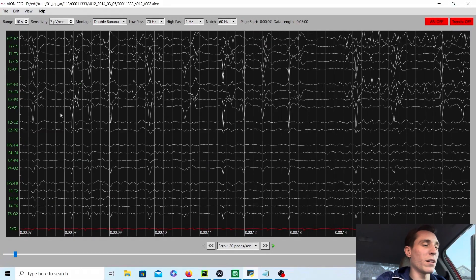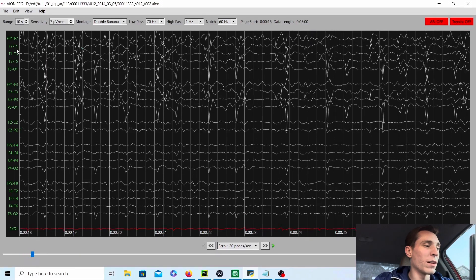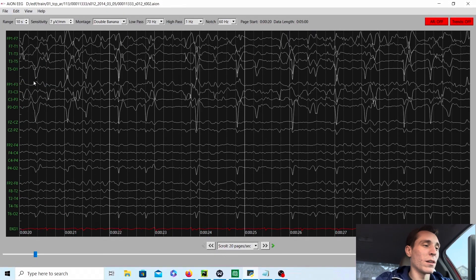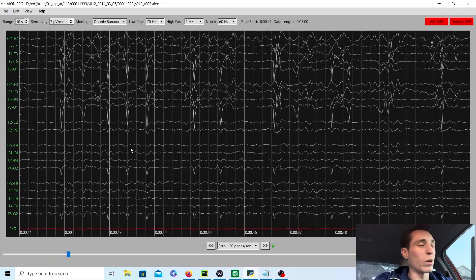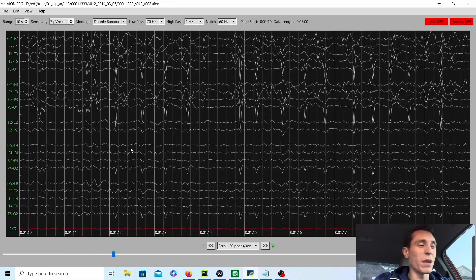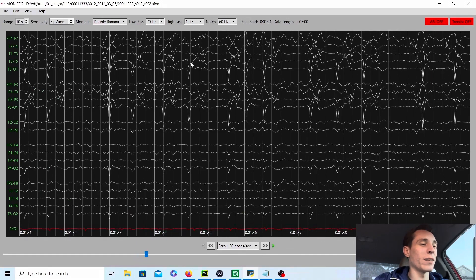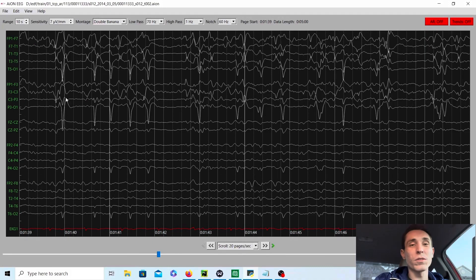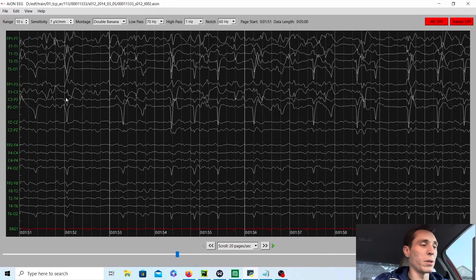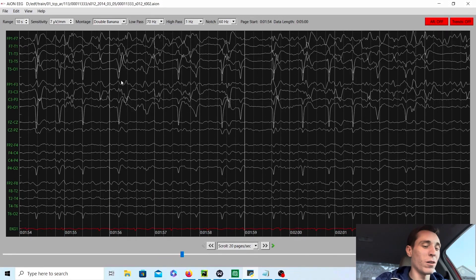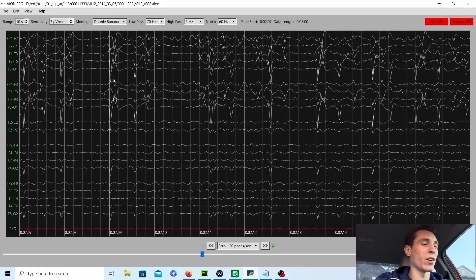The irritation is causing some epileptic activity on the EEG, which I'd like to show you now. So when we first open this record, we see a clear asymmetry. The left side — these electrodes, the odd numbers — obviously have much more spiky activity than on the right side. This is an example of what can happen when a patient has blood sitting in the subdural space, irritating the brain, causing focal slowing and also epileptic activity. These are called lateralized periodic discharges.